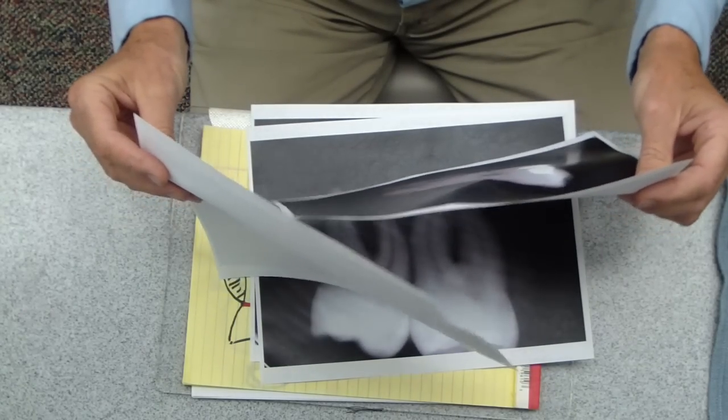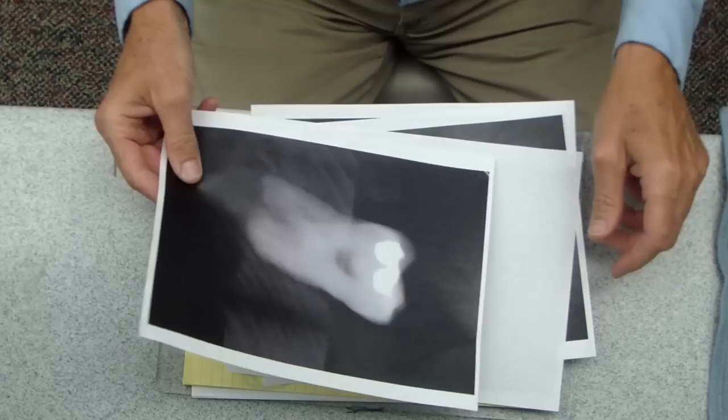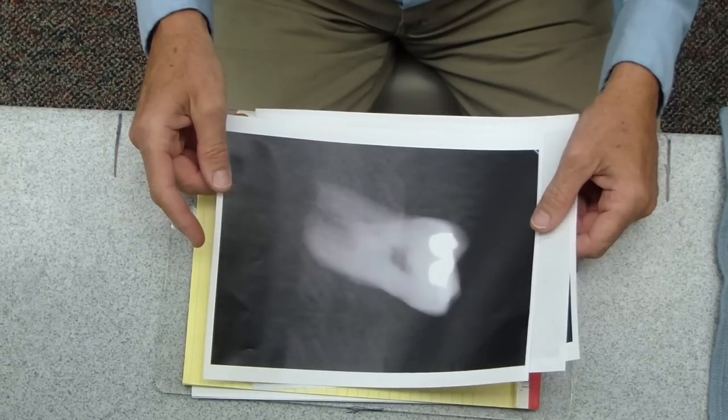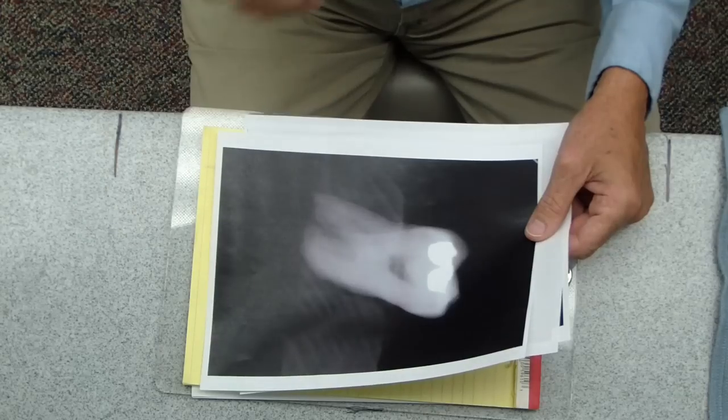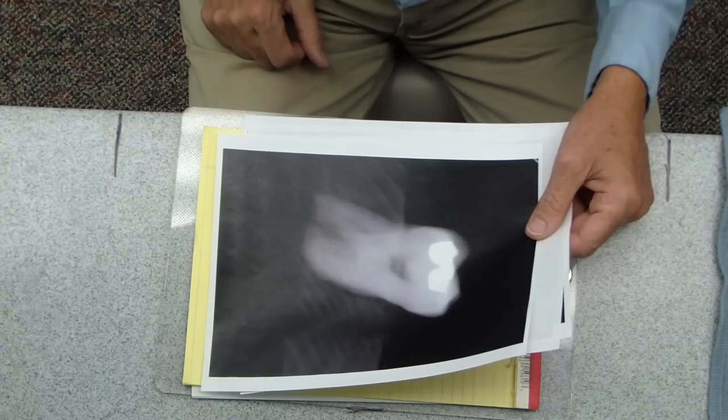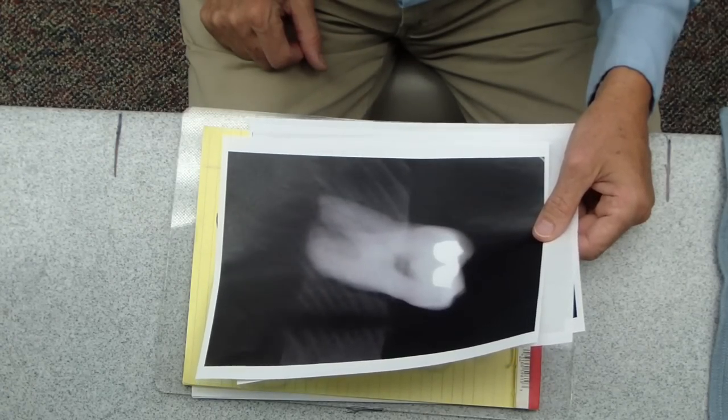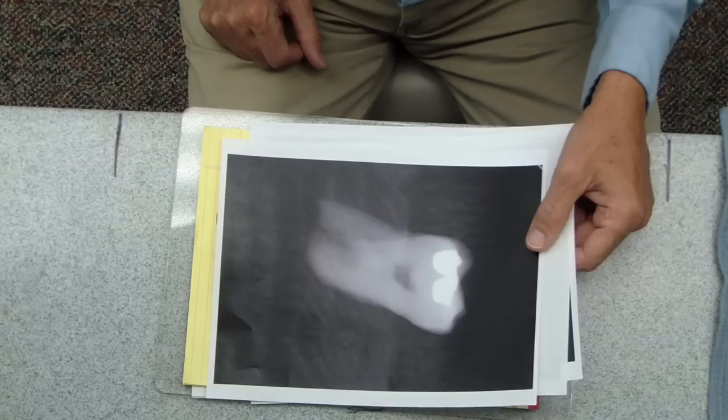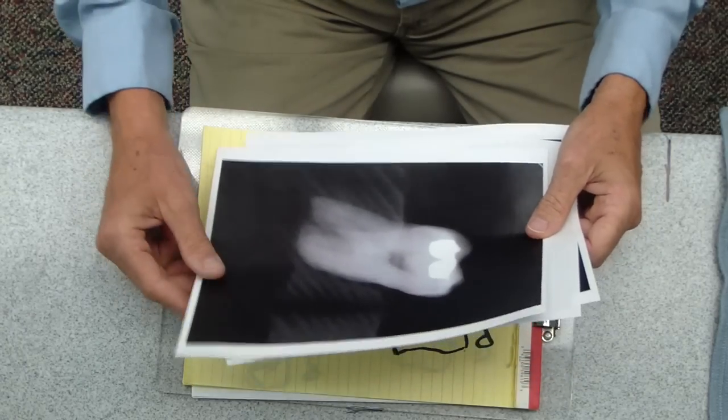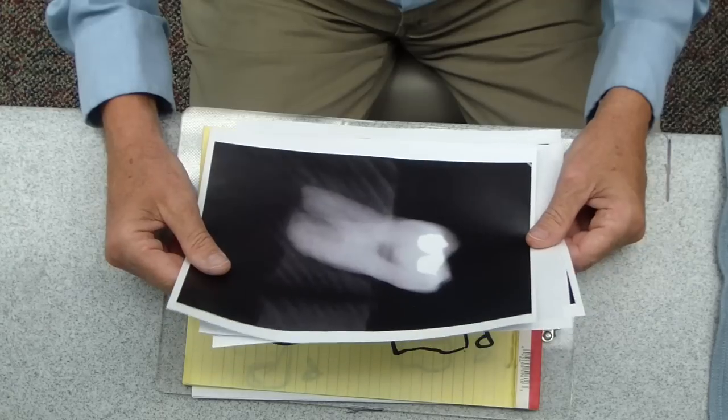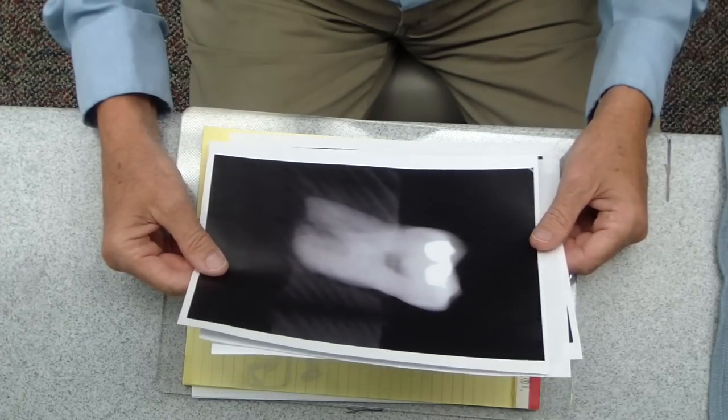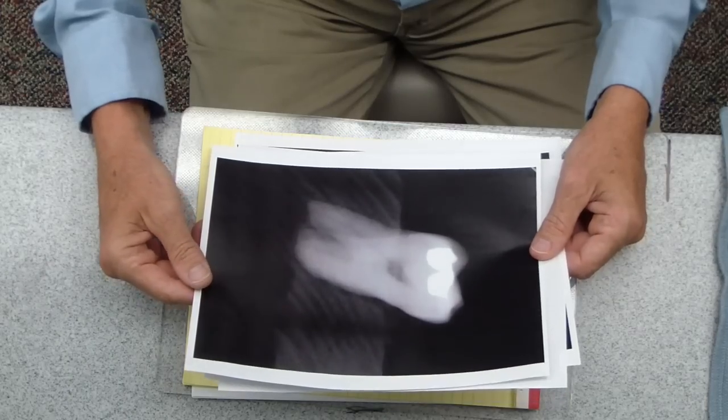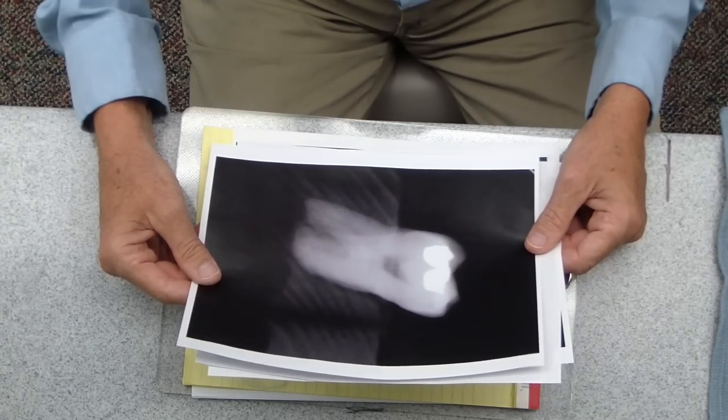The first teeth I'm going to do today is the maxillary molar. Particularly, we're concerned about isolated maxillary molars in older people. As you know, sometimes you can have full pneumatization of the sinus, and the bone is very compromised. If you just grab it with the forceps and torque it out, you'll end up with a very large oral antral opening. So with these teeth, if they don't come out really easily, I always find it's best to go ahead and section them.